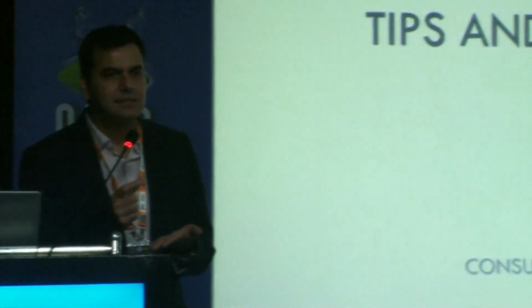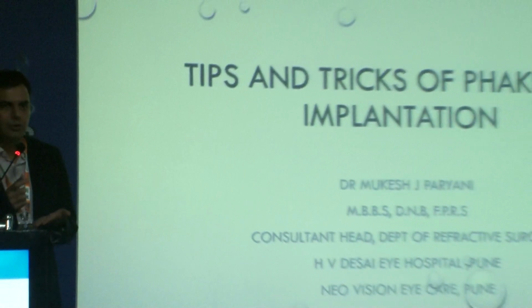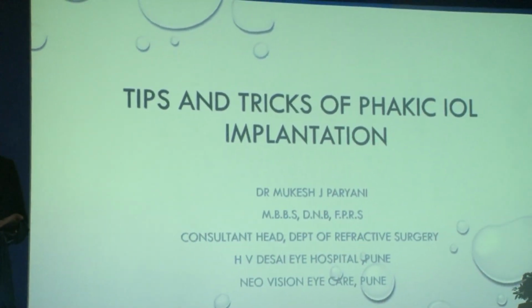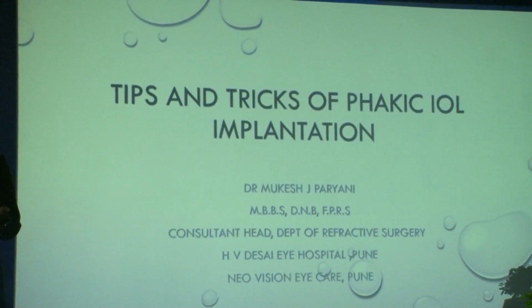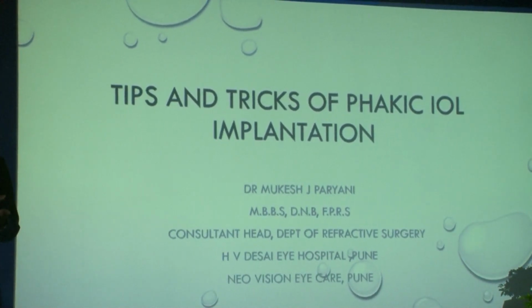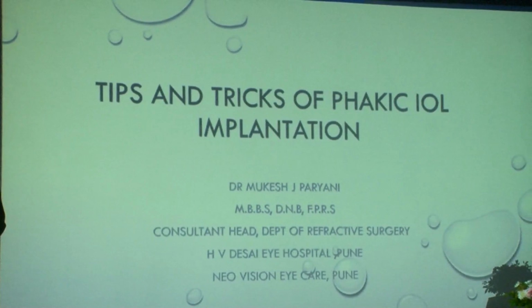But as we go for the higher dioptric power, for example, if you're planning something which is more than 14 or 16 diopter lenses, these lenses are very thick in the mid periphery. So although you may have a good vault in the center, the mid periphery may be a little shallow. So if you have a higher dioptric power, the chamber depth minimum should be 3 mm.